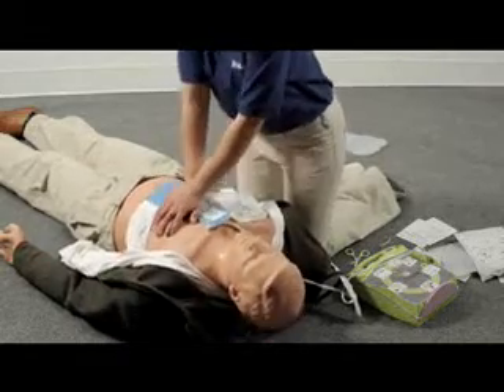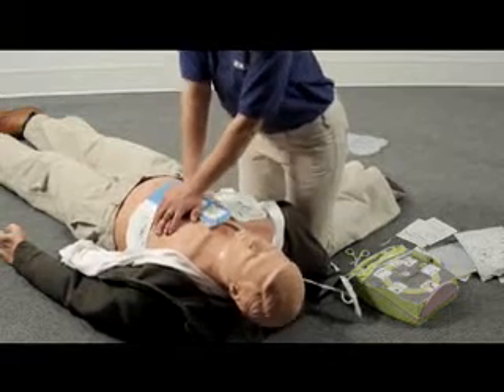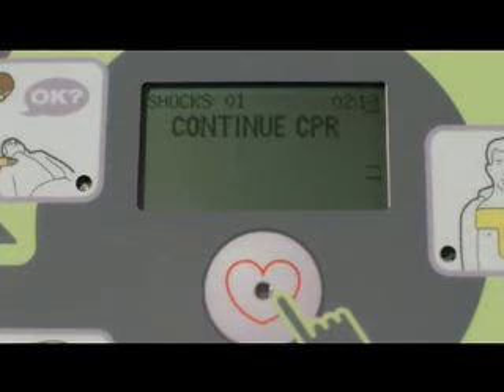If you don't start CPR right after being told to do so, you will be prompted every 10 seconds until you do start. And if you stop for longer than 10 seconds, the AED Plus will tell you to continue CPR every 10 seconds until you resume.